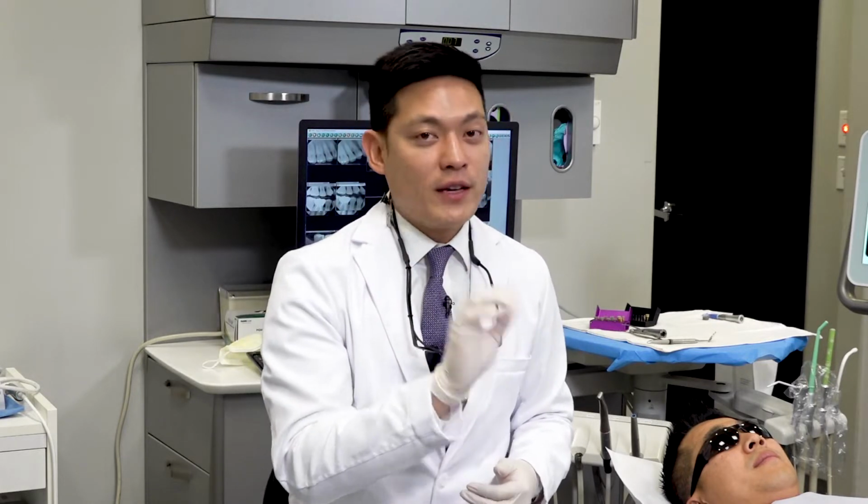So another critical aspect of our digital impression is to avoid any sort of distortions, noise, misalignments in our digital model. And that would basically appear as any sort of area of our digital model that just does not look right. It doesn't look like the patient's teeth. Misalignments would appear as layers to the teeth. And if you notice that's incorrect, the patient truly doesn't have that, which most shouldn't, you want to try to stop and deactivate the camera, remove that from the model. Each scanner has a different method of deleting areas from the digital model. Catch that early. The ideal is to catch it as it's developing, but it is important when you're analyzing your model to keep an eye out for those things.